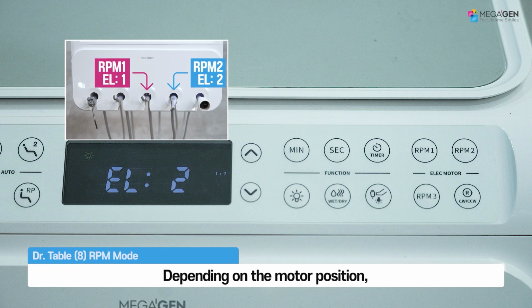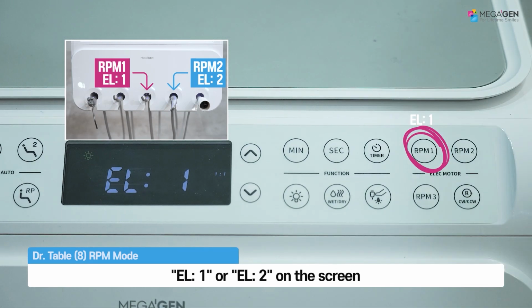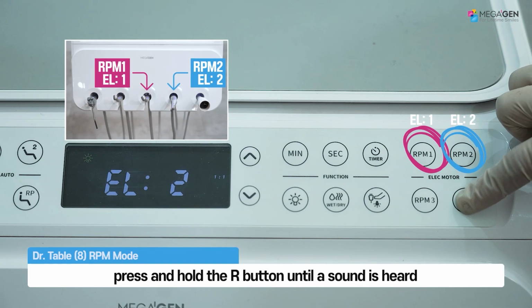Depending on the motor position, pressing the corresponding button will display EL1 or EL2 on the screen. Finally, to save the set RPM, press and hold the R button until a sound is heard.